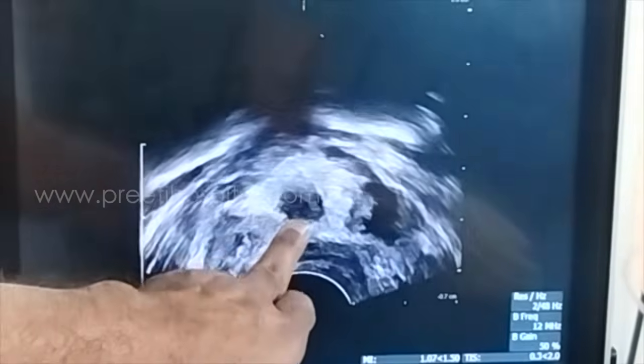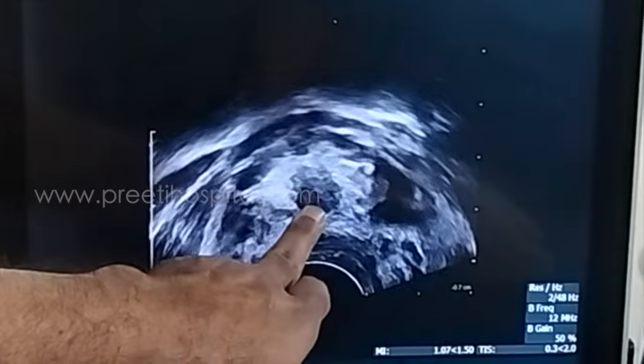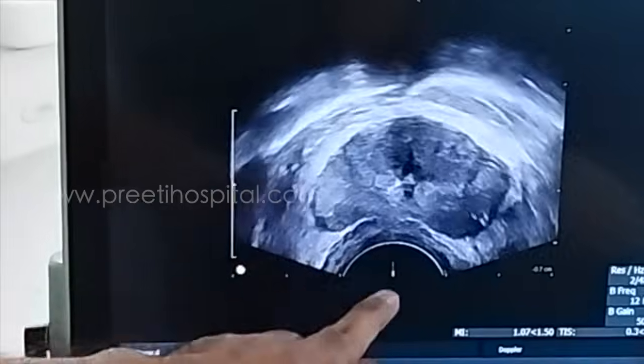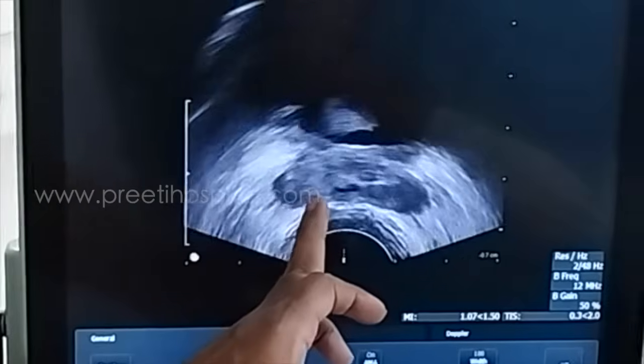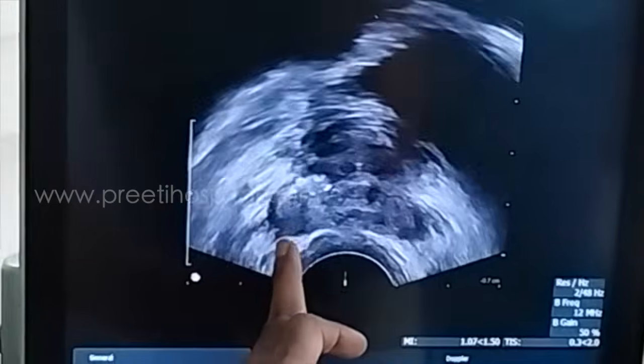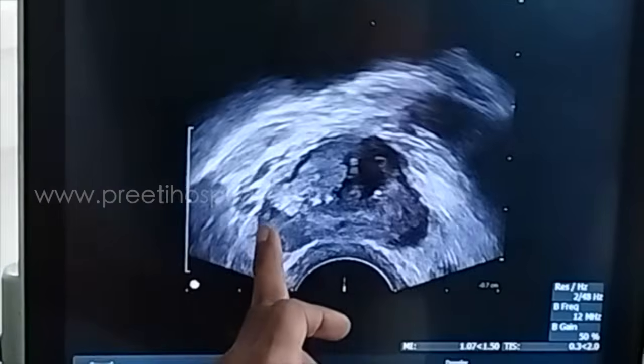And this down is the urethra. This is the bulbar urethra, or maybe the membranous urethra. Yes. And now if I do a biopsy, sorry, come down. If I do a biopsy like this, one here, it will give periphery.